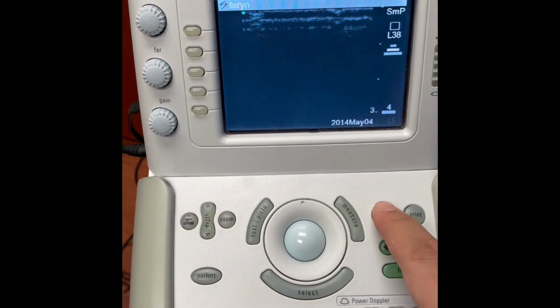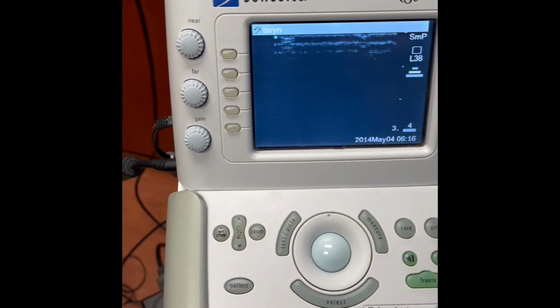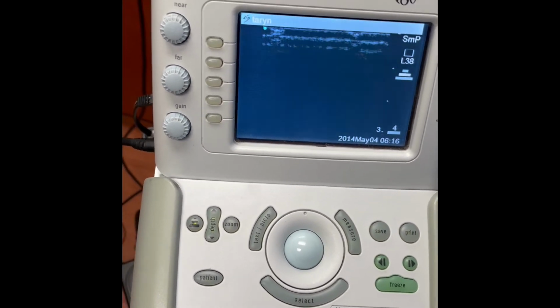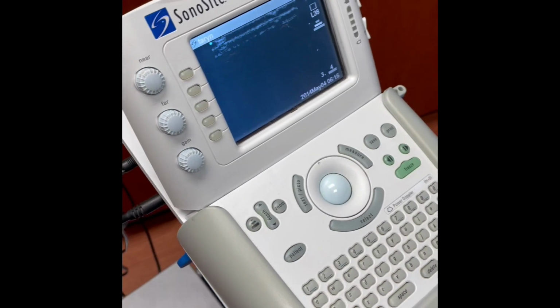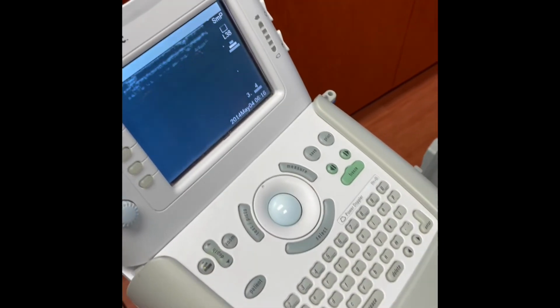Once you hit freeze, you have to hit the save button. It saves the imaging, and then afterwards, one of the MAs can go back and actually Athena capture the images, as Taryn is so nice to say, and then Dr. Sharp being our nice probe expert here. So she's ready for us to do a lot more of these, and hopefully everyone kind of goes with that.